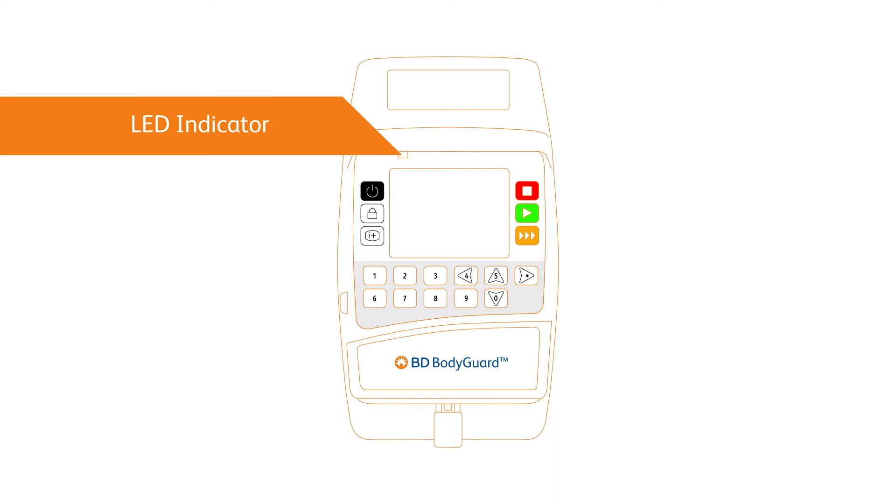Flashing yellow indicates a medium priority alarm, requiring a prompt user response. Flashing red indicates a high priority alarm, such as end of battery alert or occlusion in line, needing immediate action. Flashing green confirms the infusion is in progress.